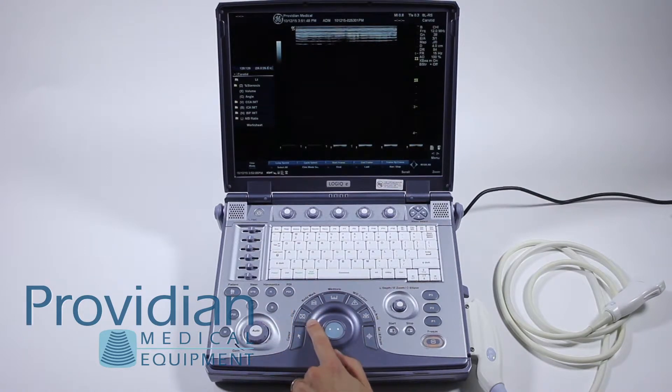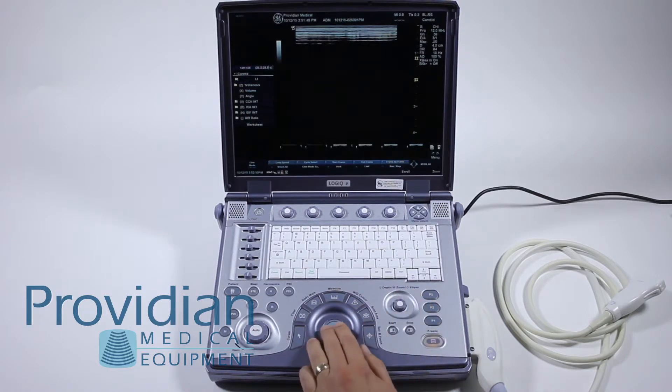The following keys are used in measurements: clear, measure, set, and ellipse. You can also use the trackball.